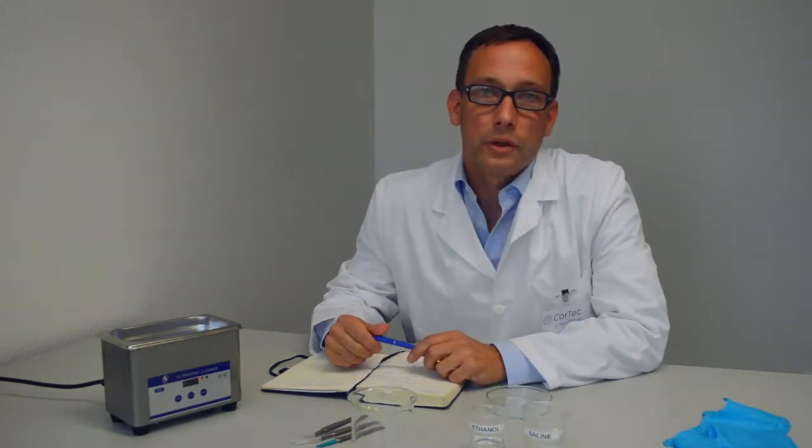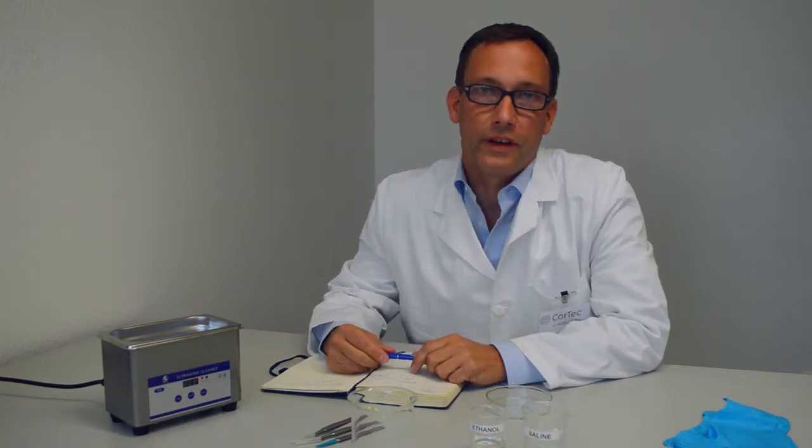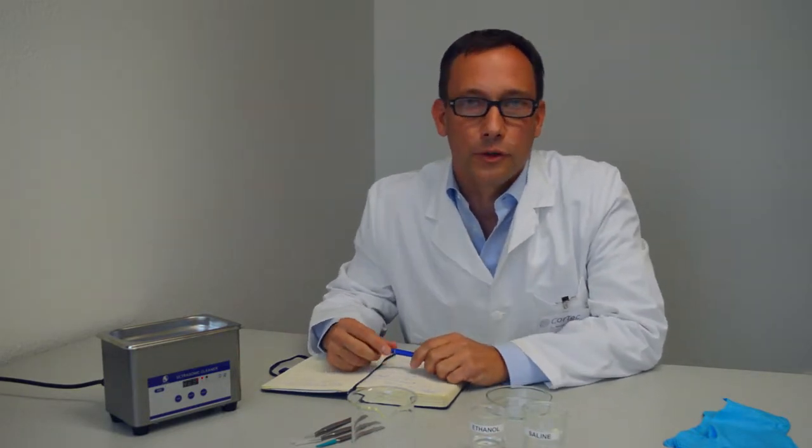Hello, I'm Martin Schüttler, CTO of Cortec. Today I'm going to show you how to implant our array tunnel cuff electrodes in a slightly different way than you would typically do it.